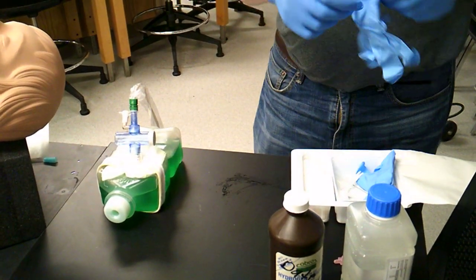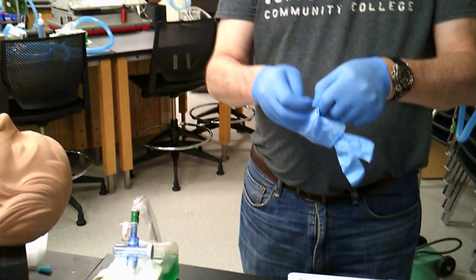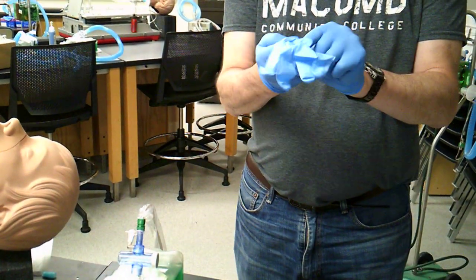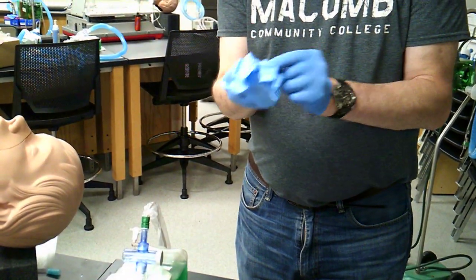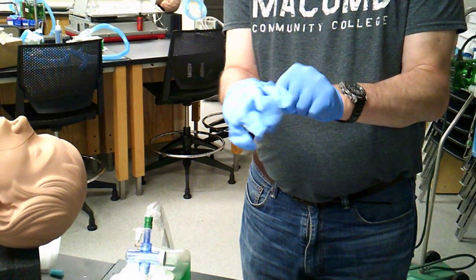So we have sterile gloves, and we'll do this the same as we did for the open suctioning. One glove will be considered sterile. The other one will be considered non-sterile.